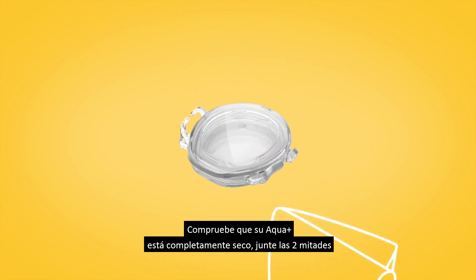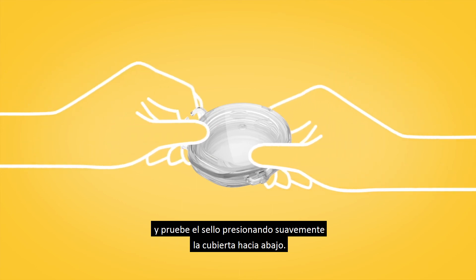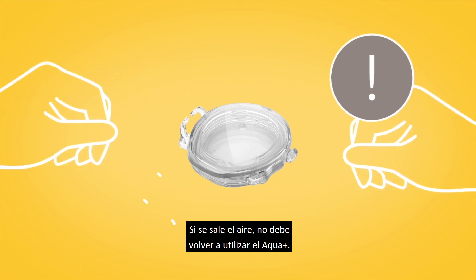Put the two halves together and test the seal by pressing down gently on the cover. If any air leaks out, you should not use your Aqua Plus again.